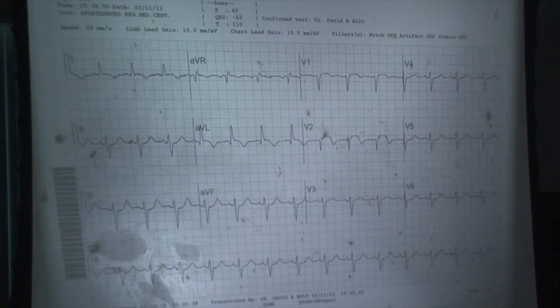Can you see from there? A little. We got them with the RL was the rate, if I'm right here, is about 75 or so.